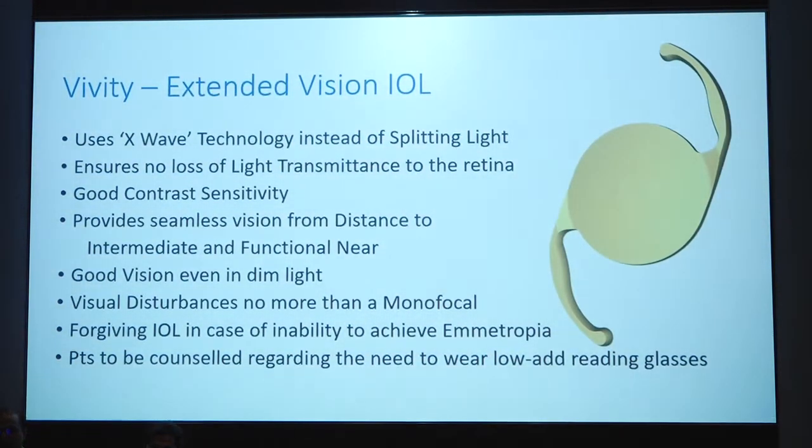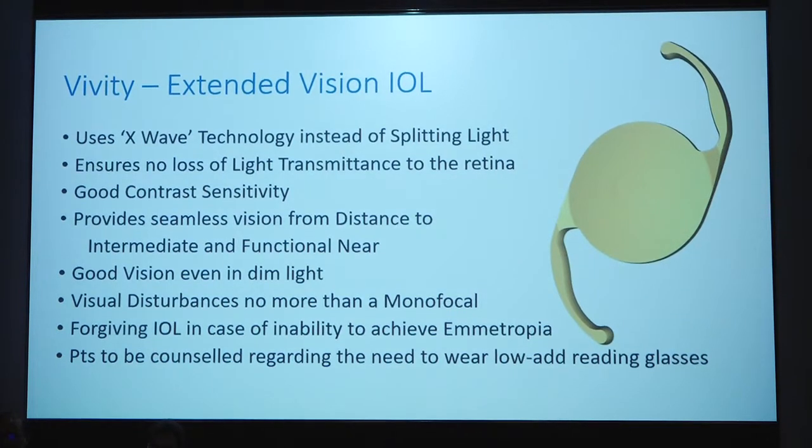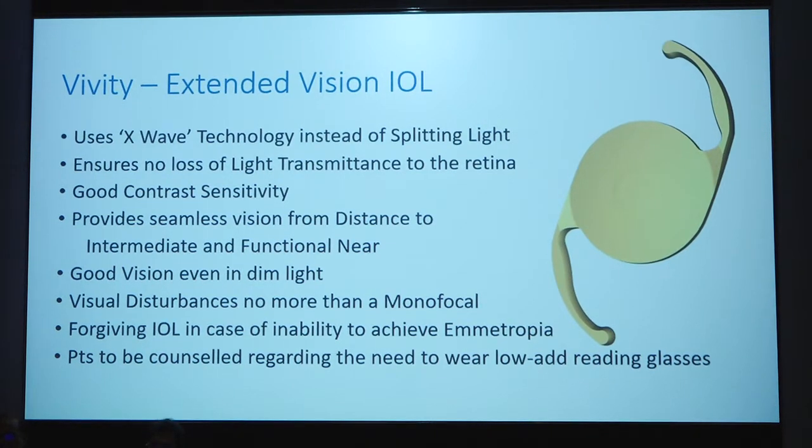So I'm going to share with you my little experience with the Vivity, which I've been using for some time. It principally uses X-wave technology in which instead of splitting light, as you see in diffractive IOLs, it causes a stretch of the focus so that one is able to see things from distance to intermediate to almost functional near. Now, there is complete utilization of light and no light is lost when you use this particular EDOF lens. Hence, the lens provides excellent contrast sensitivity and the patient can see very well even in dim light.